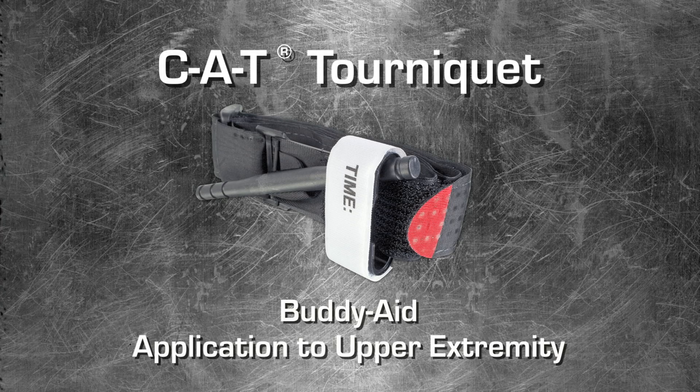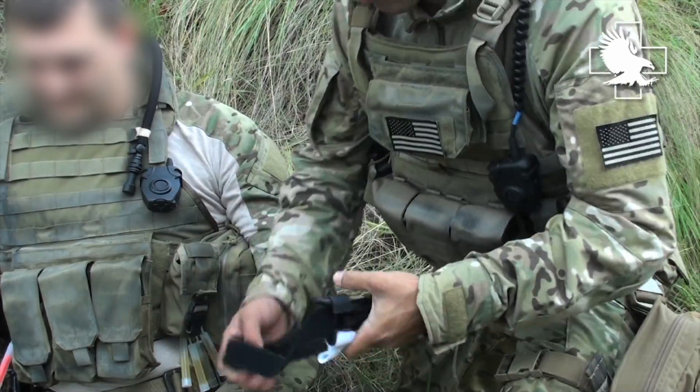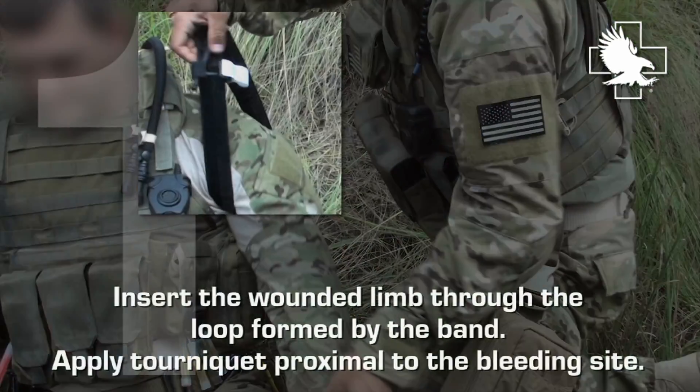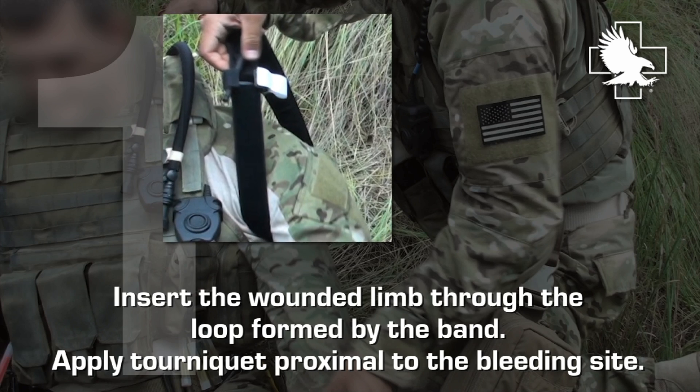Welcome to the CAT tourniquet video tutorial: buddy aid application to upper extremity. Insert the wounded limb through the loop formed by the band. Apply tourniquet proximal to the bleeding site.